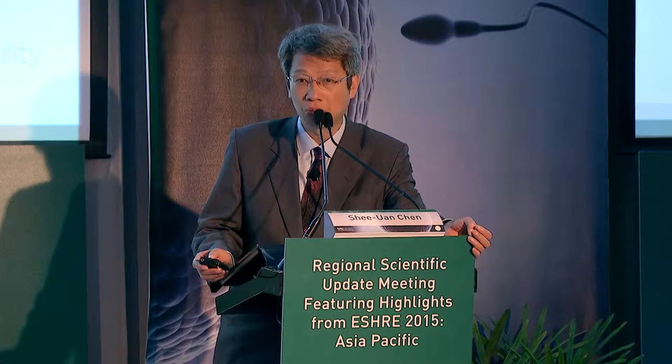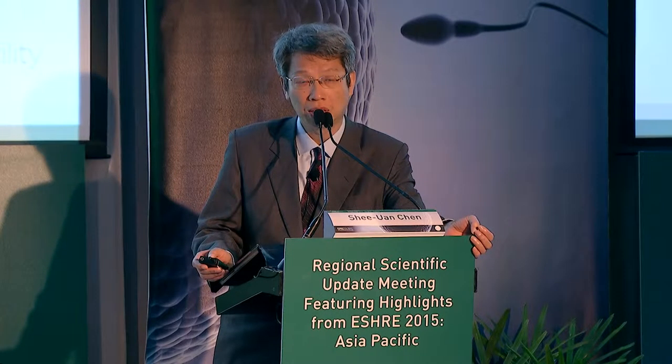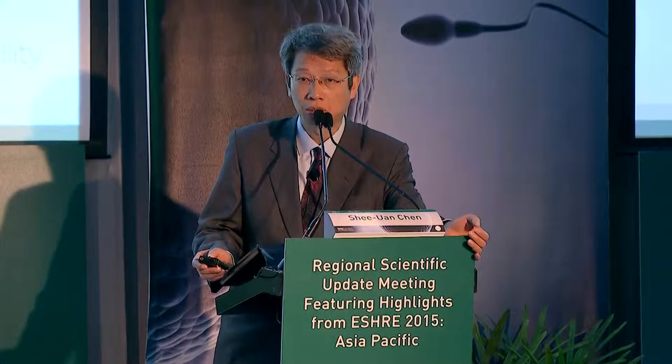So the closed system is common in Europe to prevent contamination or disease transmission. But the open system is commonly used in Asia, I think, because it has a high success rate in the lab. So we use the open system in my hospital. But we will discuss the efficiency of the closed system. And we will further discuss the cryoprotectants used for oocyte freezing or vitrification. How the components may affect the survival rate of oocytes or even the pregnancy rate.